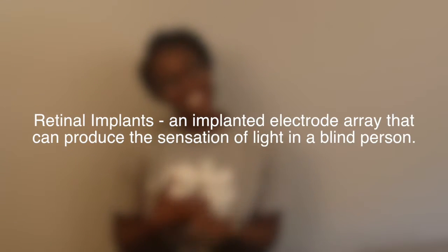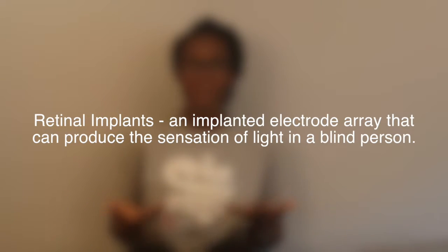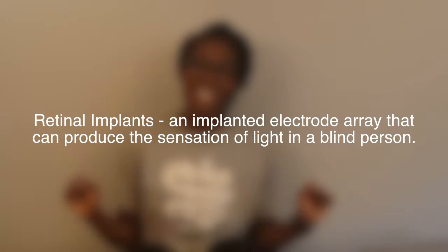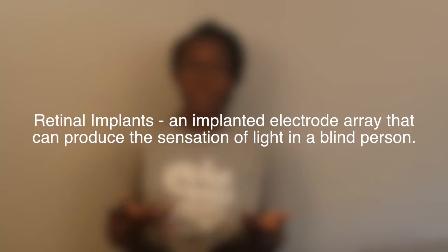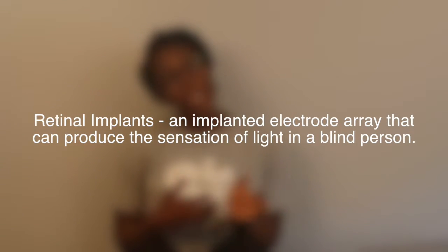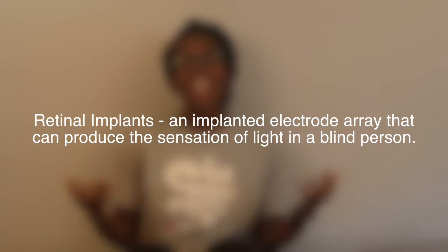Also, another type of implants are retinal implants. And as you know, many people lose vision due to age related macular degeneration or retinitis pigmentosa. But the neurons in the retina that receive electrical signals from the photoreceptors might still be activated by electrical pulses. In this way, the implanted electrode array can produce the sensation of light to a blind person.